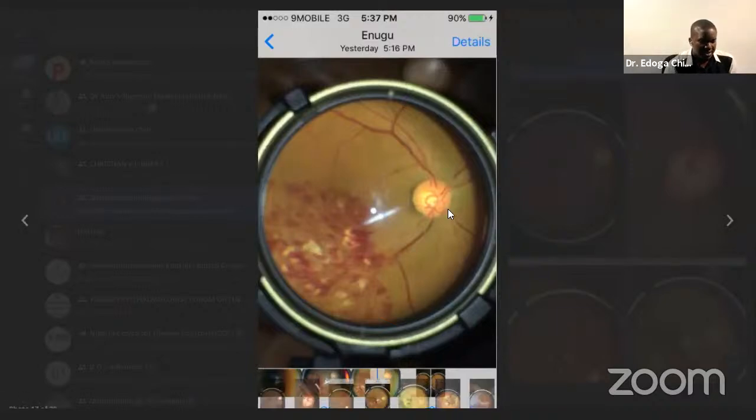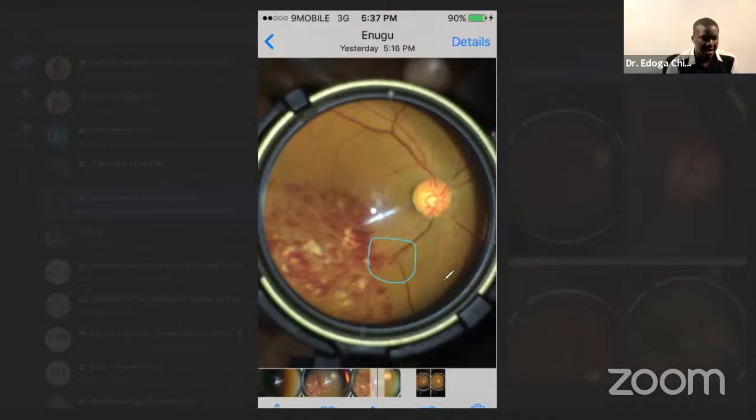You can actually see the points of the veno-arterial crossing here, where the occlusion took place. So these are things that you get with an iPhone that may be difficult for you to get clearly with other phones. And you can still see the light artifacts that I talked about as a result of the reflections coming from the anterior and posterior surfaces of the condensing lens.